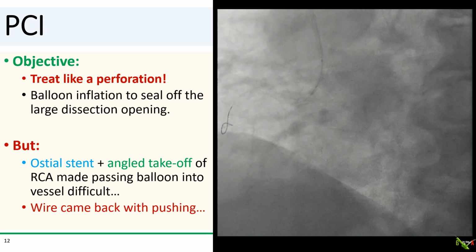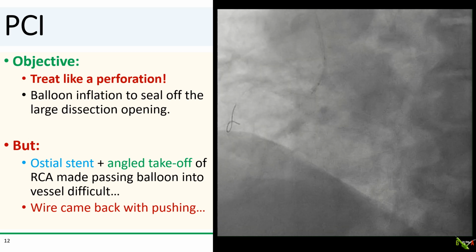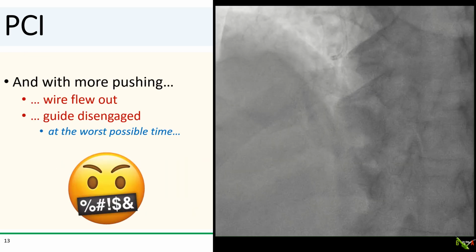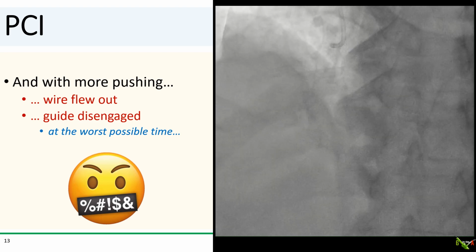The FFR wire kept coming back with all of the pushing of the balloon forward. And with more pushing of the balloon, the FFR wire flew out and the guide disengaged. I cannot think of a worse time to lose wire. We had a wide open perforated dissection into the aortic wall and a freshly stented ostium right at a shepherd's crook.